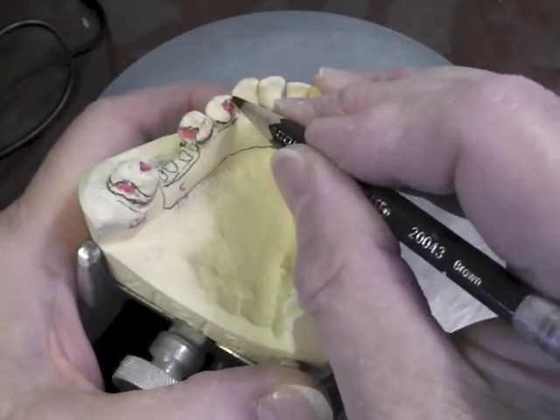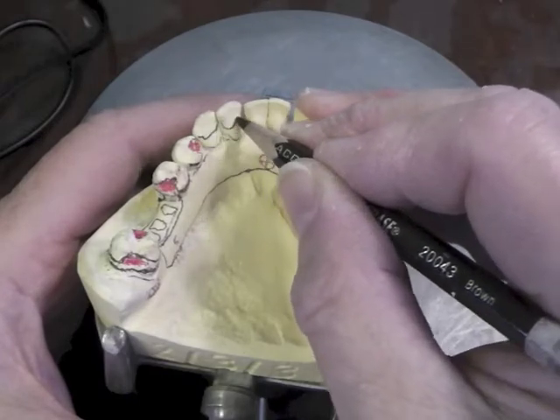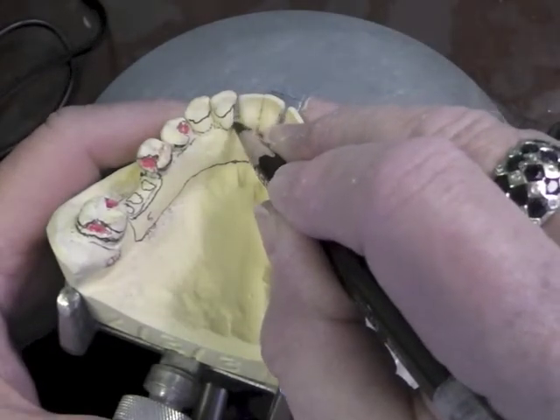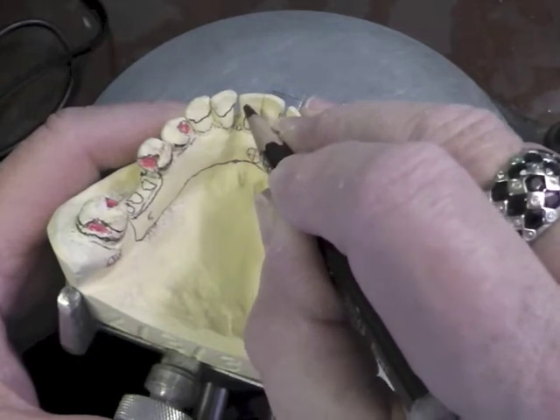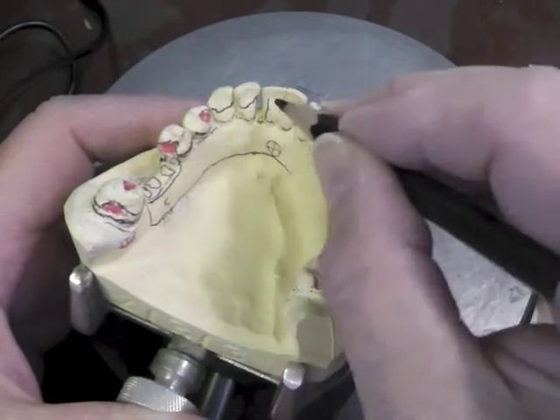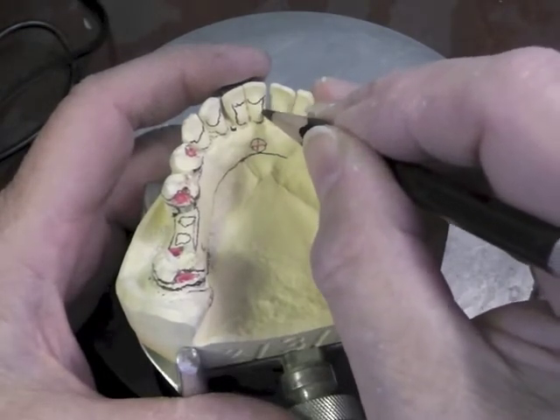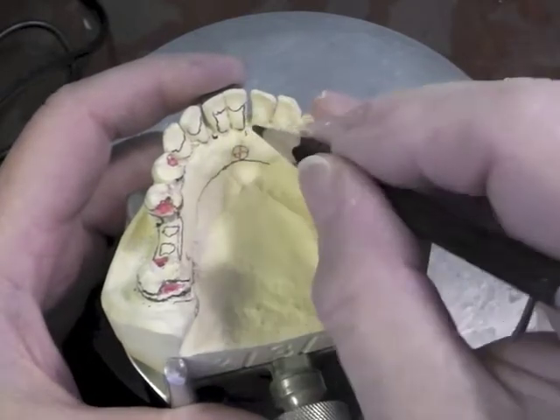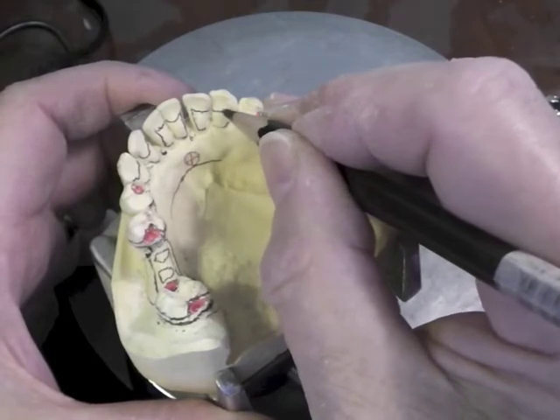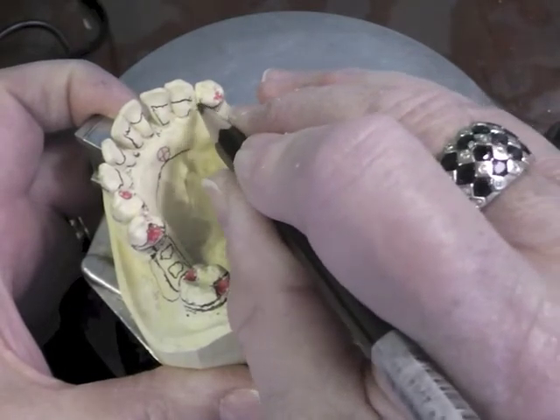Our major connector we decided is going to be lingual plating. So the lingual plating covers the cingulum of the tooth and goes up to the embrasure — covers the cingulum of the tooth and goes up to the embrasure. If we don't dip down and then go back up on this tooth, we're going to see some ugly metal showing through right here. So this major connector will come up, come down right to that point, go back up, cover that cingulum, come down again because we've got another little opening right here between these two teeth, go back up the next tooth, cover the cingulum, go to the contact point, cover the cingulum, and it will become the reciprocal component of this clasp assembly right here.